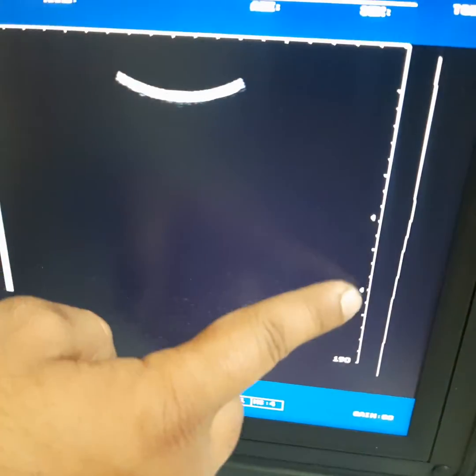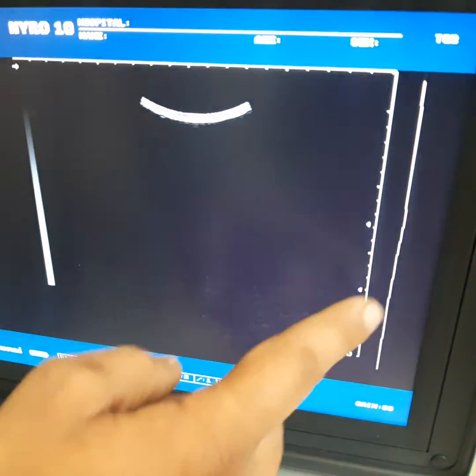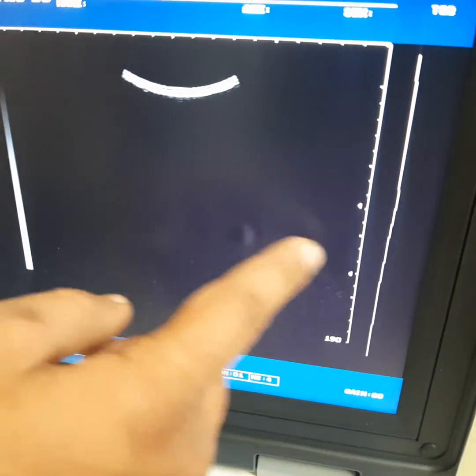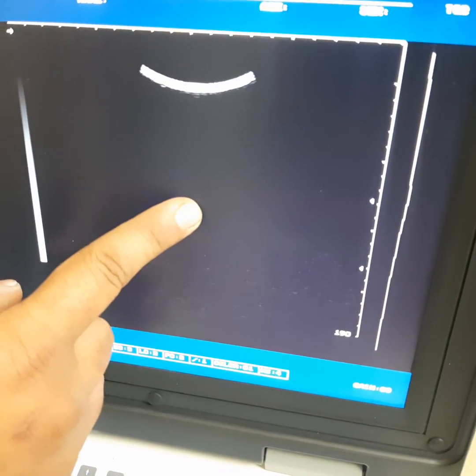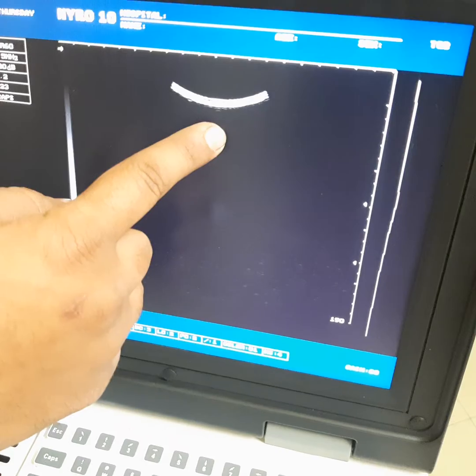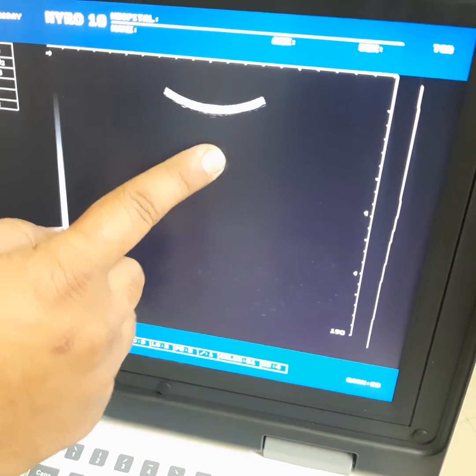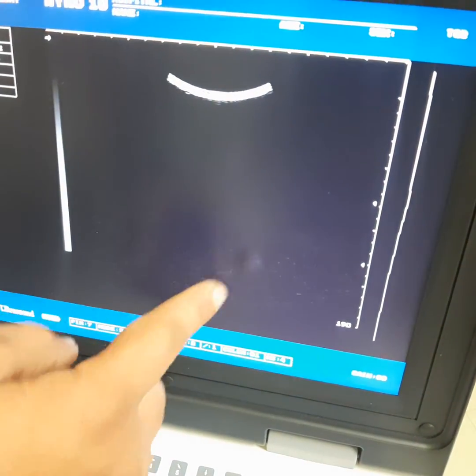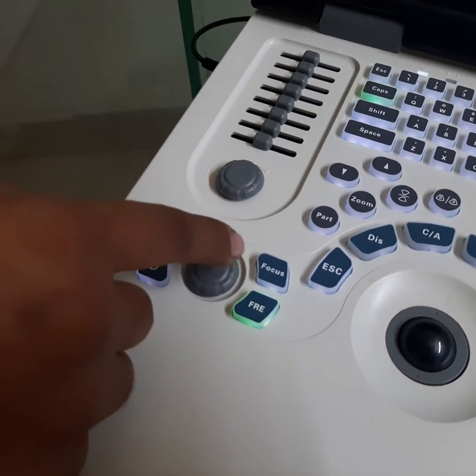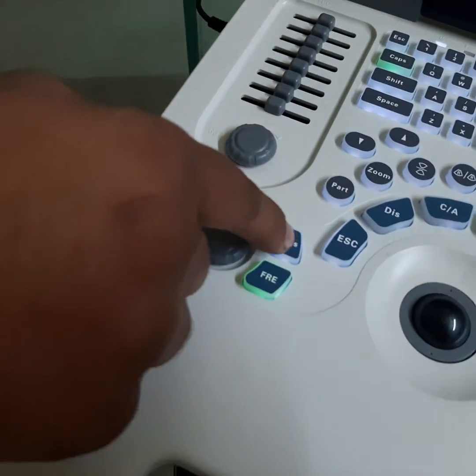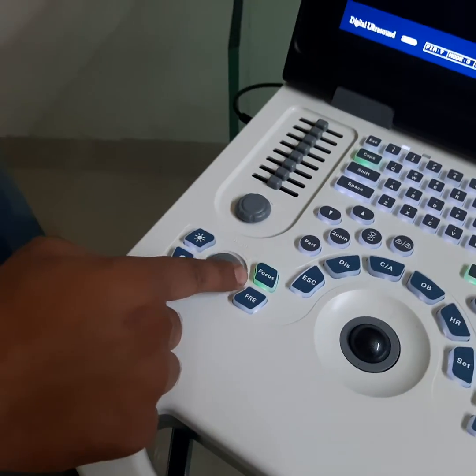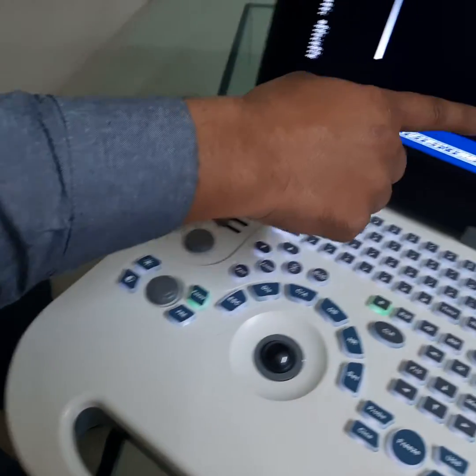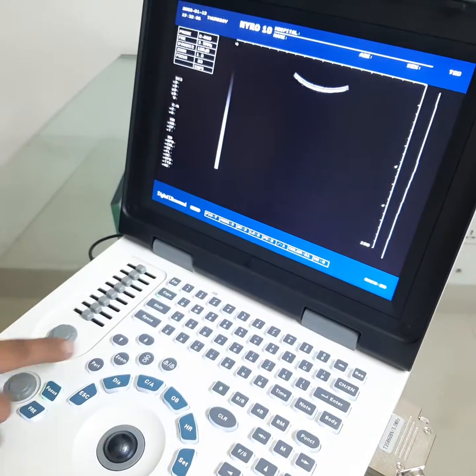These are two focus points. Normally it's in the middle to focus this area. If you want to change this area upward or downward, press this focus button and rotate this adjuster left and right to move the pointer upward and downward.